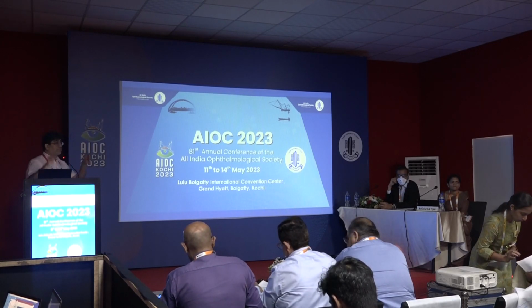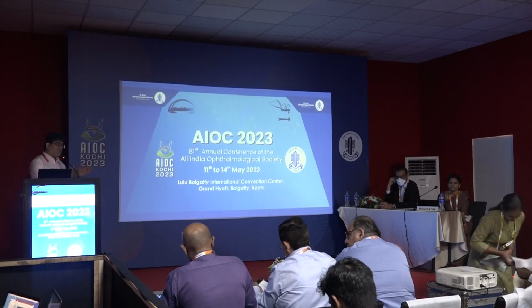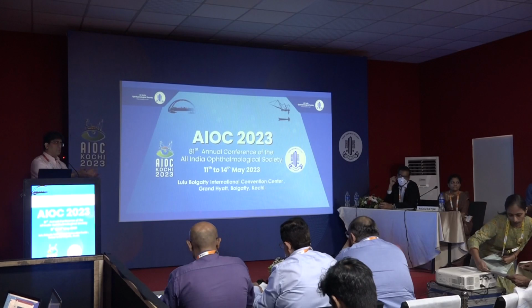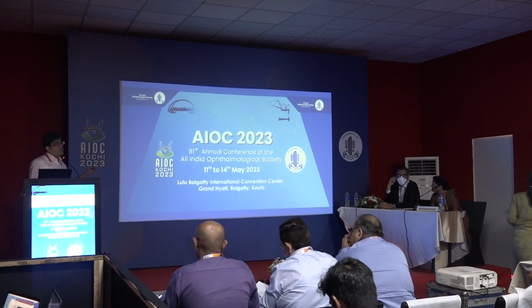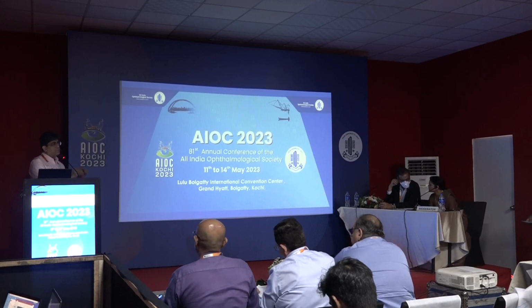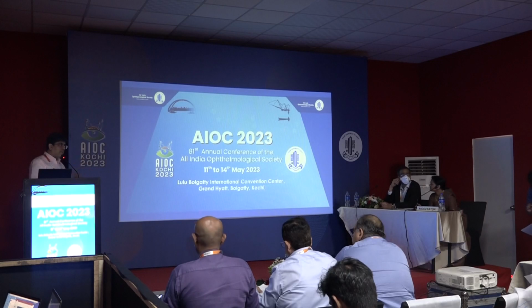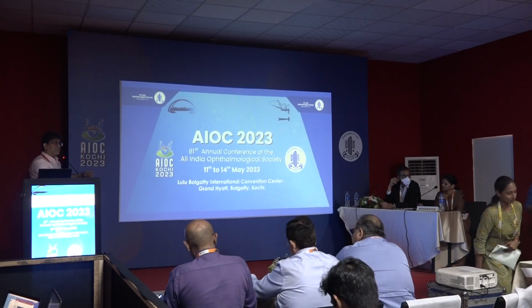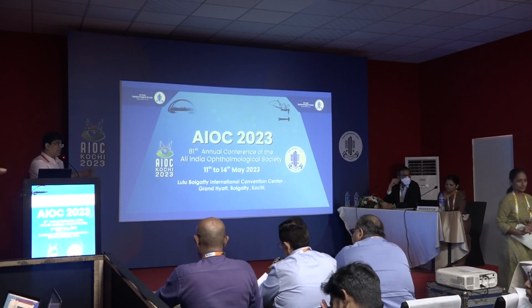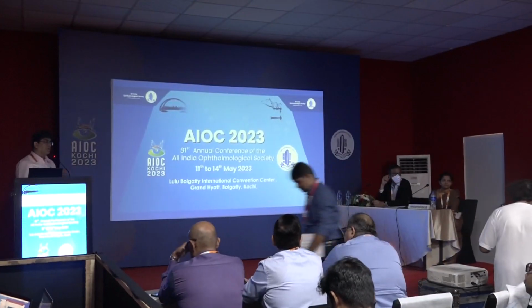However, if you scan that particular chart and project it, you can have a huge difference. You can make your own stereo acuity chart. A normal distant stereo acuity chart costs around 1,20,000. A normal, any Randot or Frisby. This is like you can scan a TNO image and project it with a projector, which can cost around 5,000 rupees. Nowadays, there are pocket projectors available. You can easily do it in 5,000 rupees. So the cost saving is a lot.